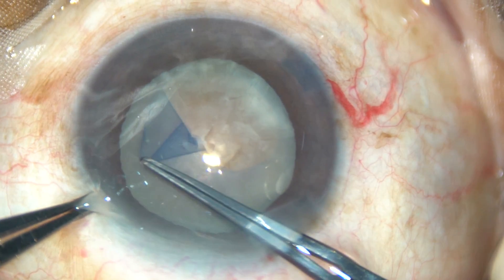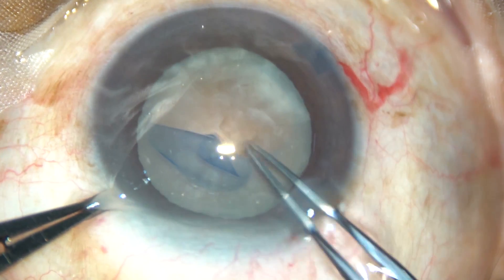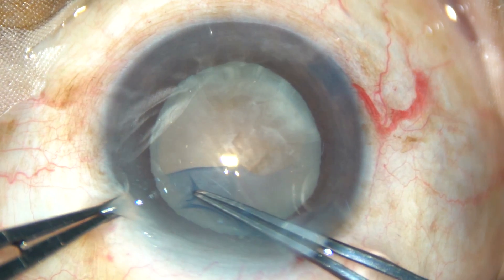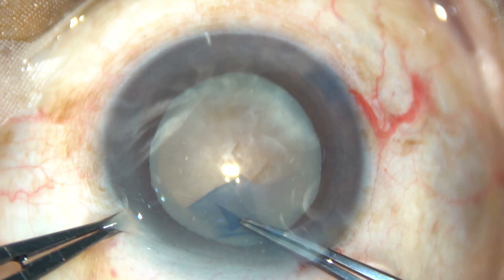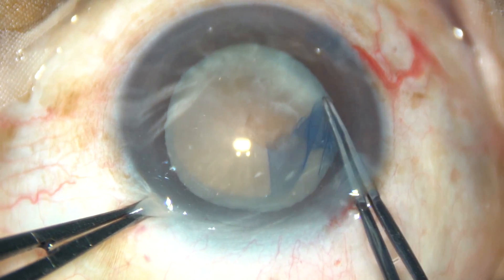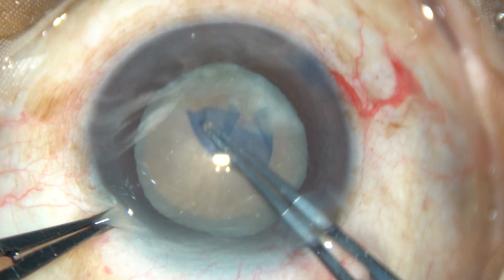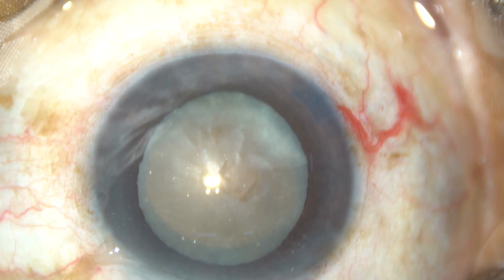Since this is a hard cataract, I want to do an adequate sized large rhexis. So I am going almost along the border of the pupil to get a rhexis of about 6 mm size.